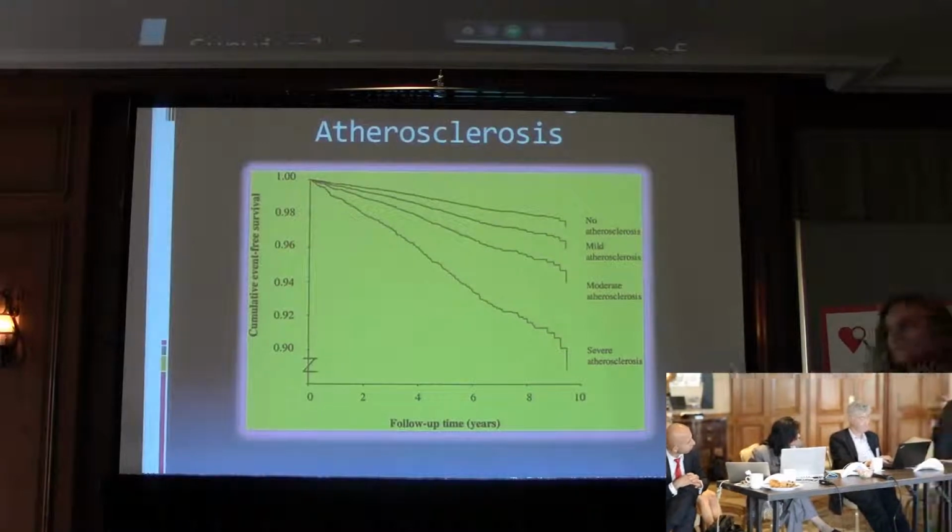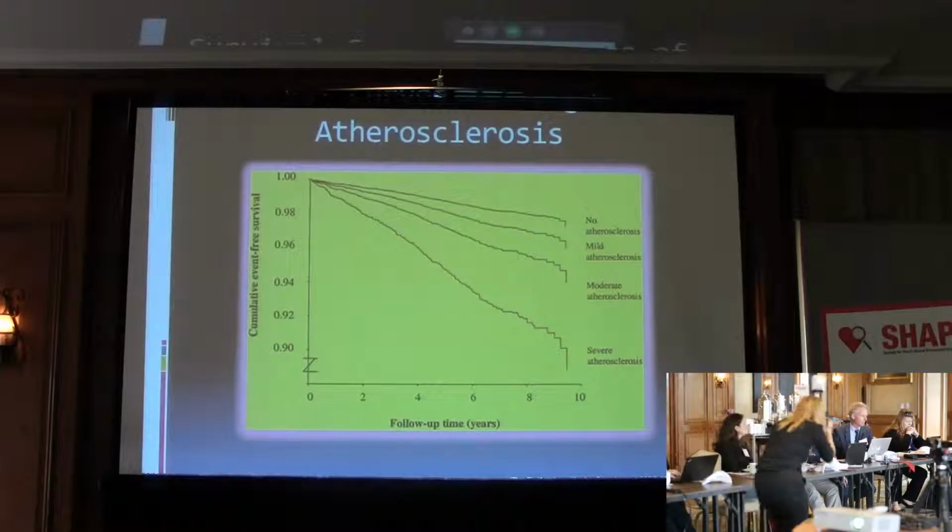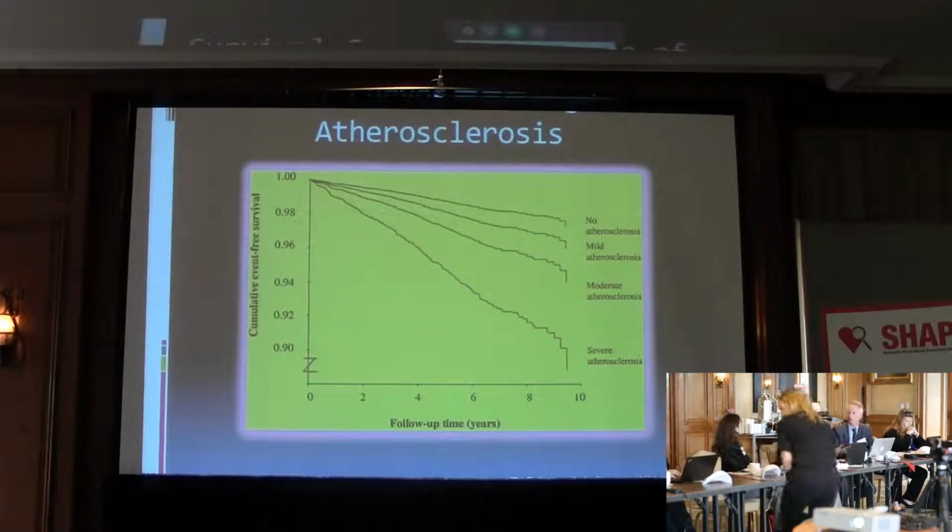So in a typical vascular surgical clinic, you will actually be looking at 60% of people with lower limb disease. And we scan every single one of them, and it's a 10-minute thing. And we also look for hemodynamics, which is obviously the most important thing, not for risk stratification. But again, as I'm going to be talking about, you can do exactly the same here that we suggest to do on the carotids. Do this cross-sectional sweep, which takes 10 seconds, and then you look at it afterwards. And I would think that the bilateral is less than 10 minutes if you just look for plaque and don't bother about measuring.